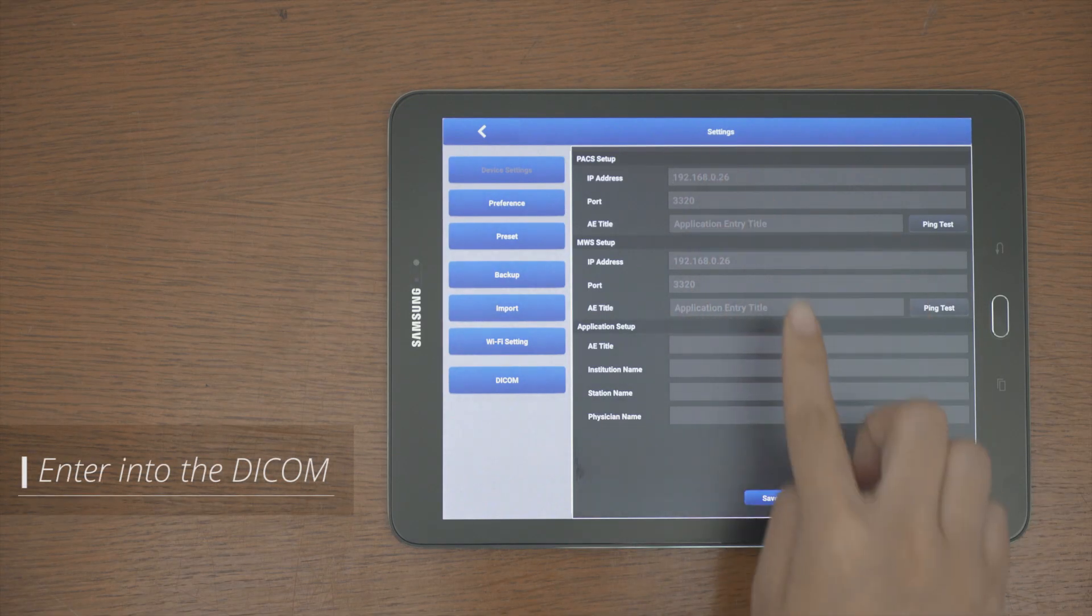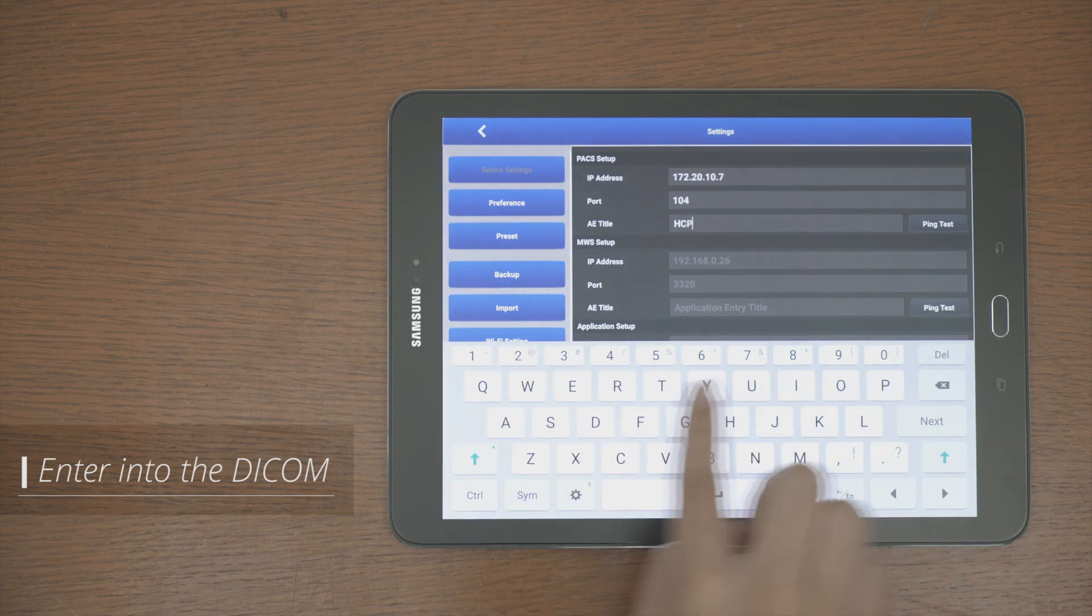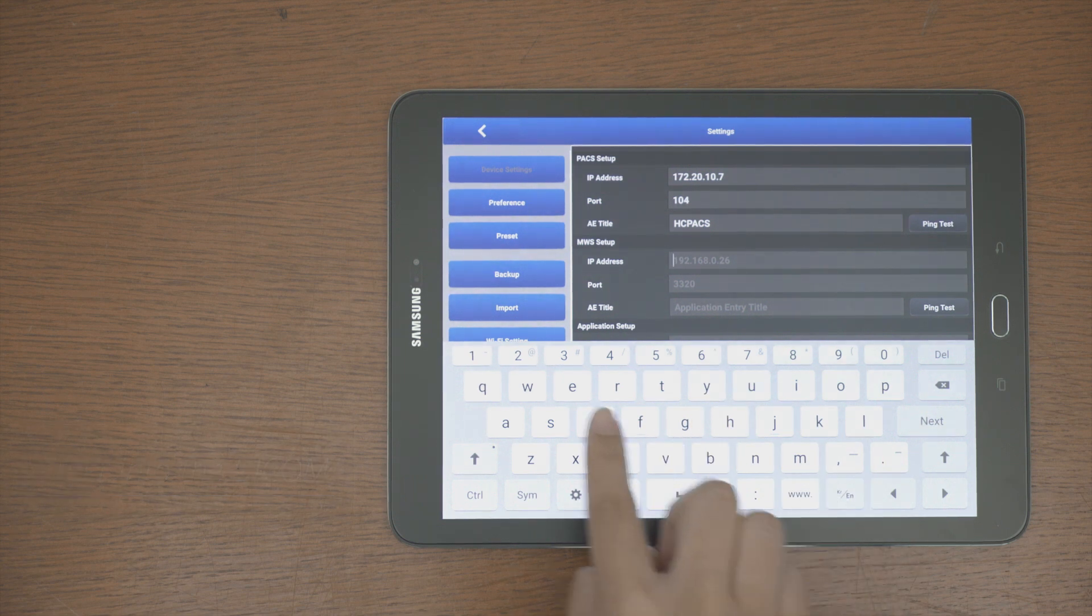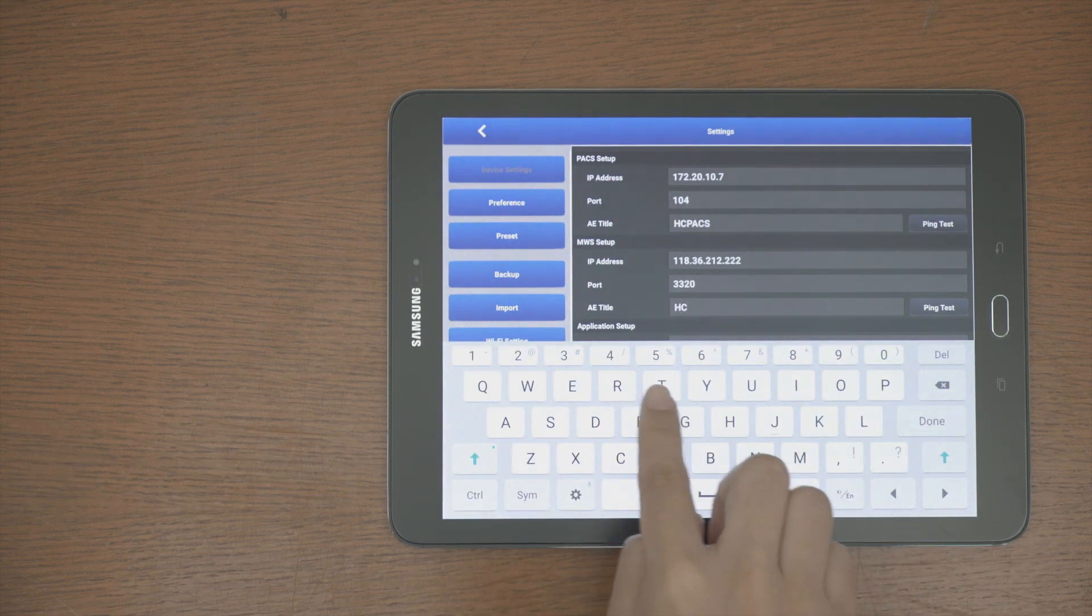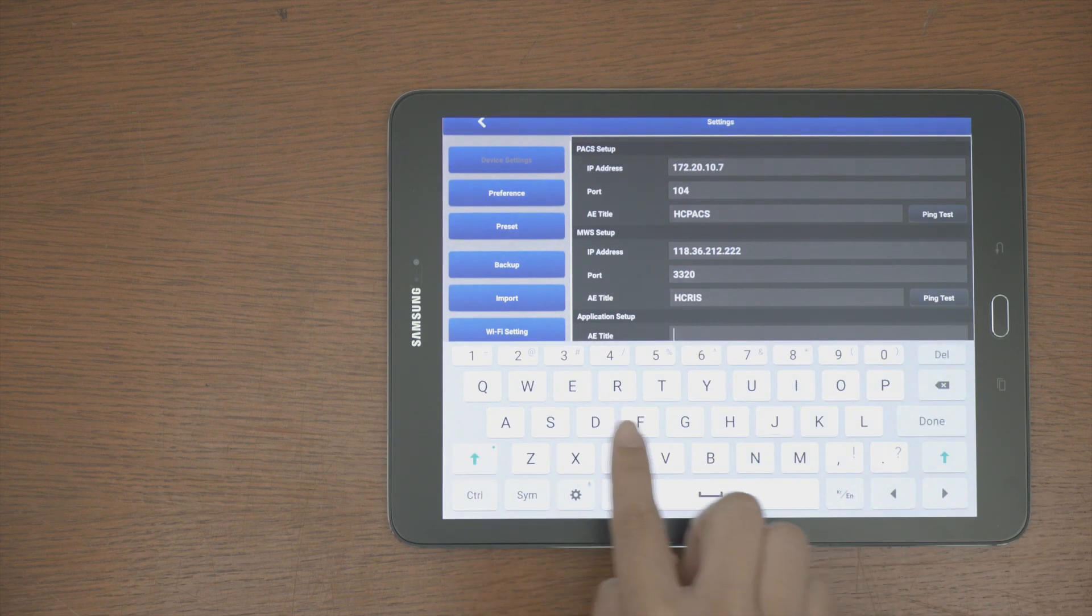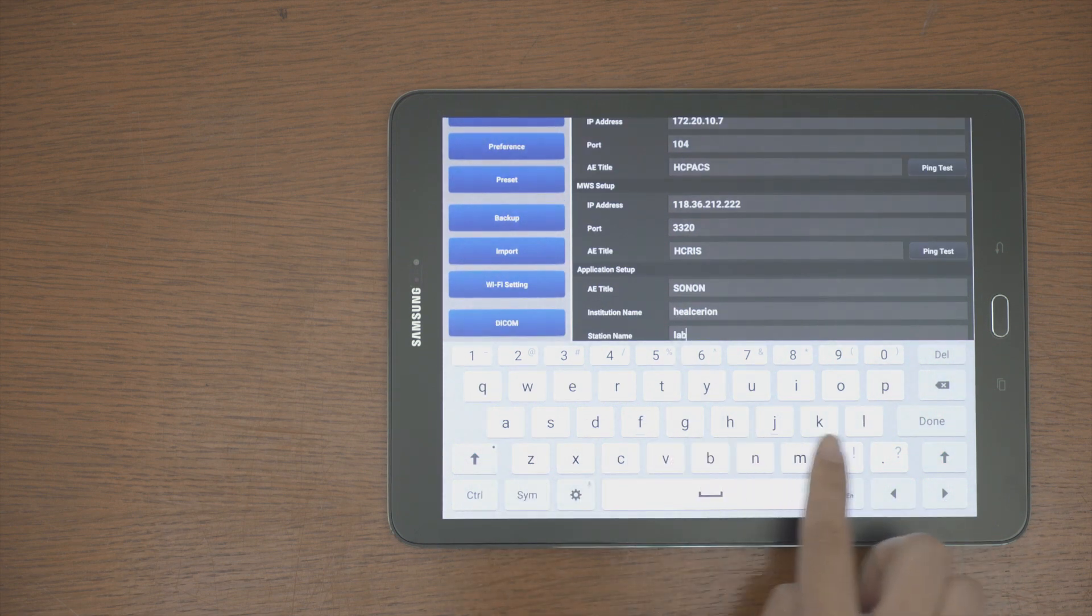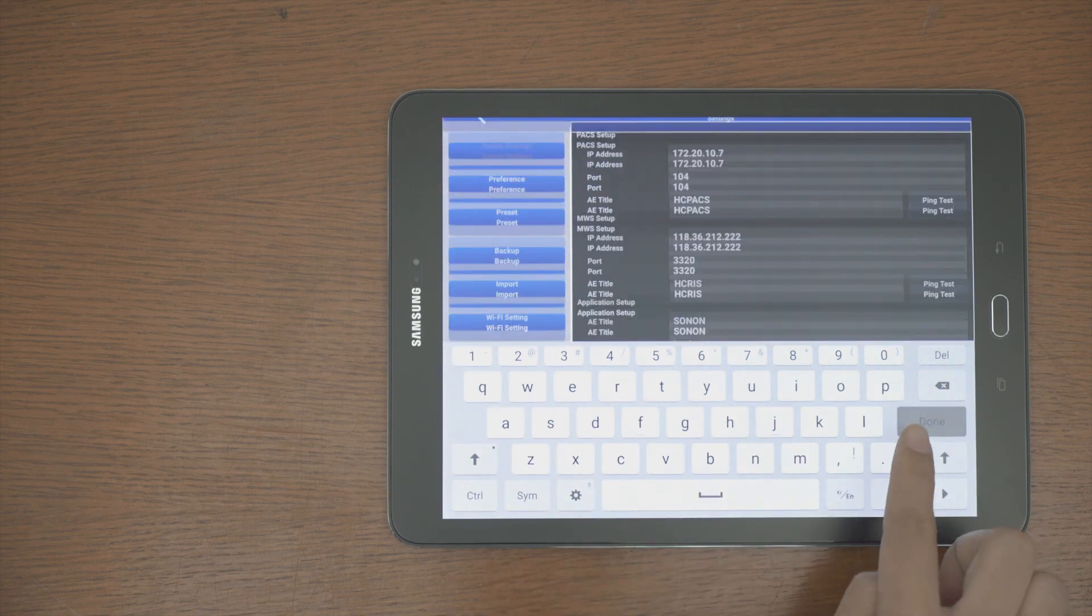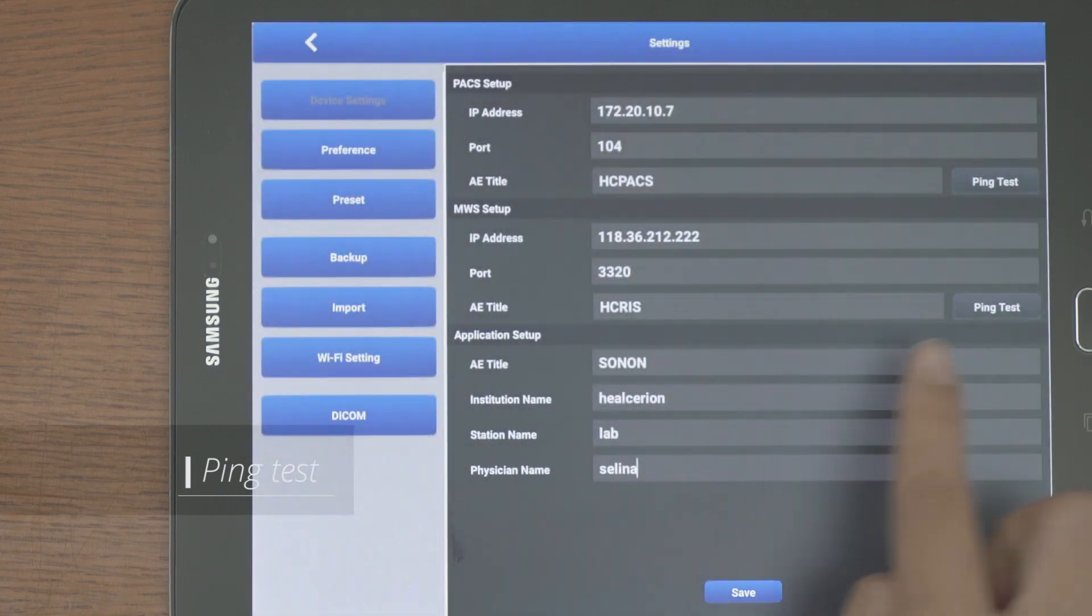Finally, to connect the worklist with PACS, enter into the DICOM screen, fill in the PACS Setup, MWL Setup, Application Setup Items.